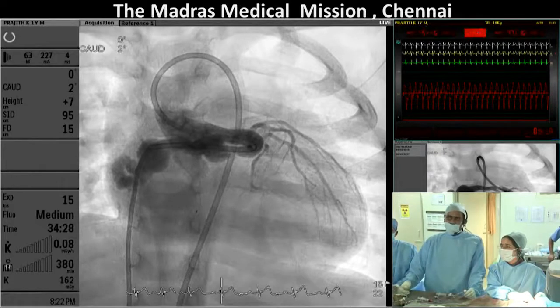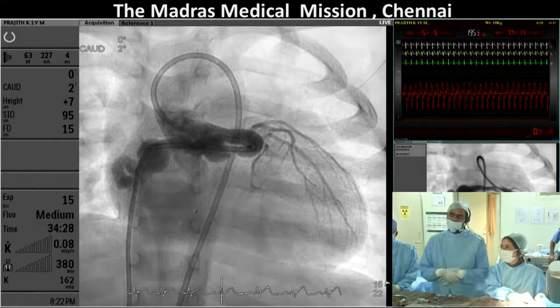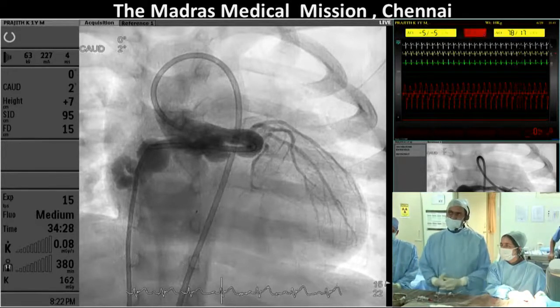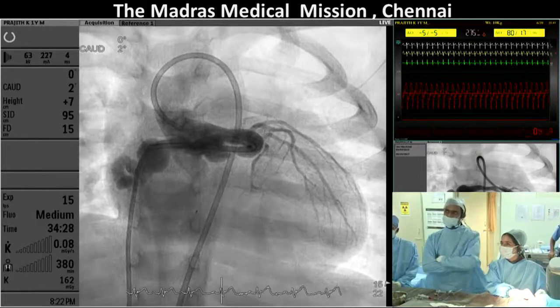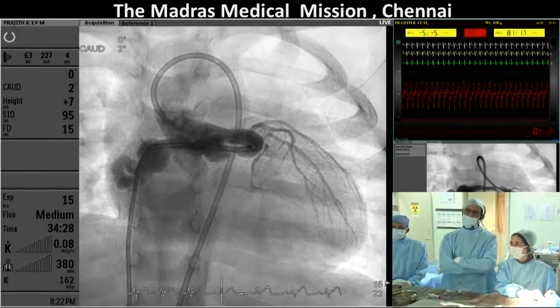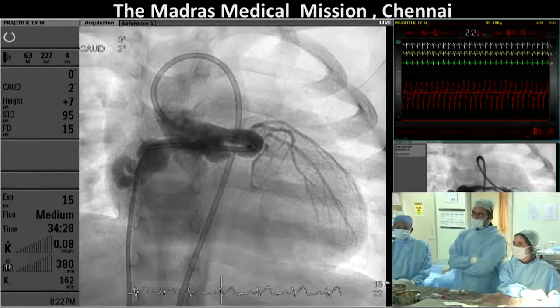I will go with something similar to what Shaq was describing. I'm going to put a smaller plug at the proximal end of the fistula, very close to the circumflex, and then fill up the distal aneurysmal sac with a few coils with my venous catheter that is already lying there.